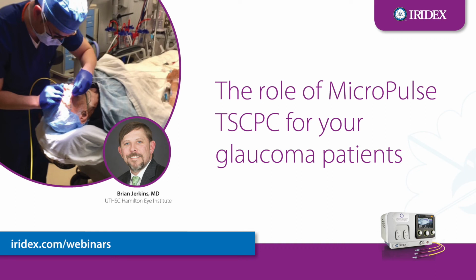So even on the patients who I might traditionally do a G-probe on, I might as well still do a MicroPulse. I'm going to get great results, and it's not going to be a difficult course for the patient. I do most of mine under just a very light sedation, and I joke with my patients, 90% of them are going to wake up right after a little bit of sedation, and they always ask, when are we getting started? So it's a very pleasant, quick experience for the patient, and that's what's kind of tipped me over, is I'm getting predictable results, maybe even more predictable than a G-probe, minus the post-operative complications, and the patients just tolerate it extremely well. So I don't really do G-probe at all anymore.